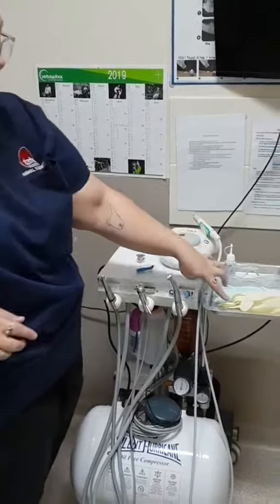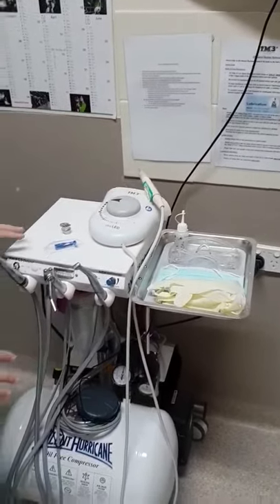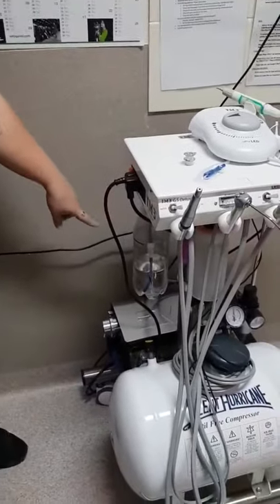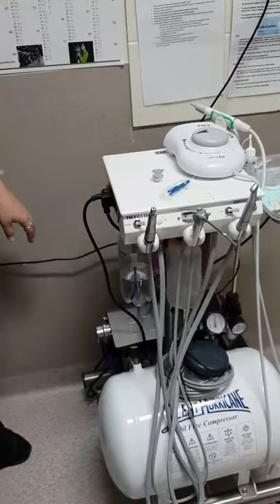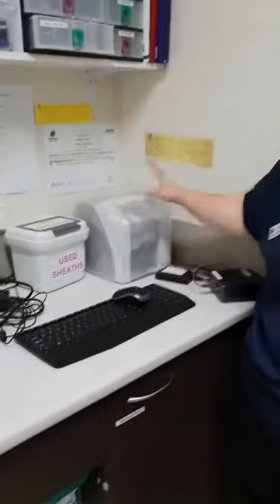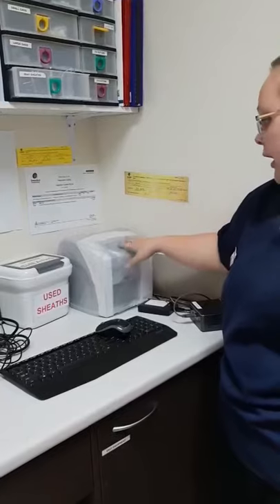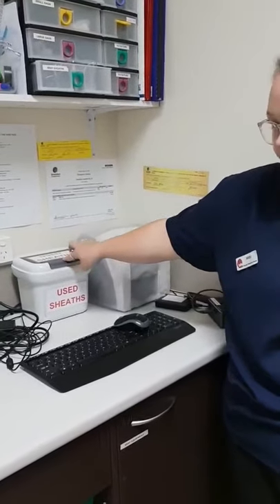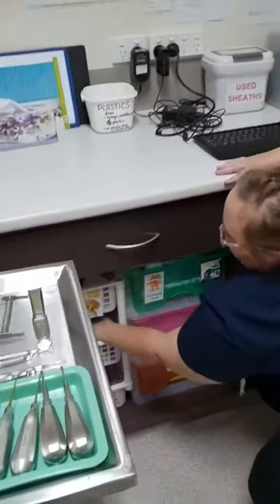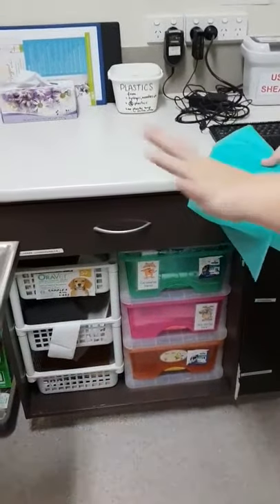We also have gloves, a mask, and goggles for our vet. We will also make sure that it has fresh distilled water, which we will change before and after each dental. We also have our dental machine, which we turn on and set up during the day, making sure it has no extra used sheaths.